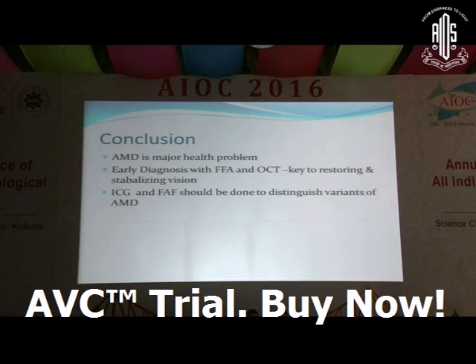So to conclude, AMD is a major health problem. Early diagnosis with FFA and OCT are key to restoring good vision. ICG and FAF should be done to distinguish between variants of age-related macular degeneration.